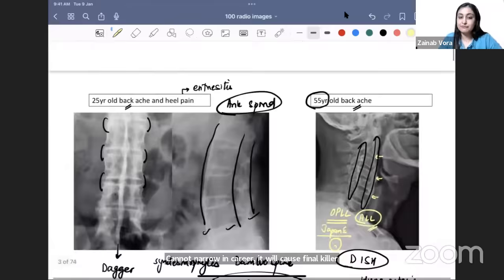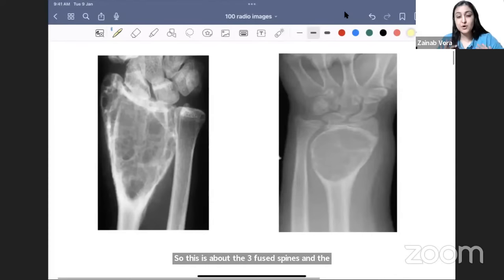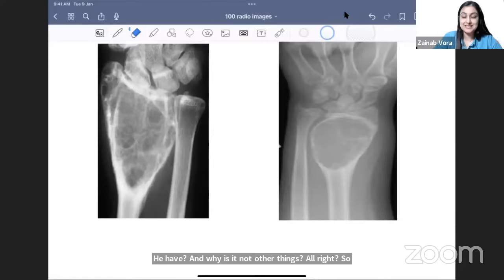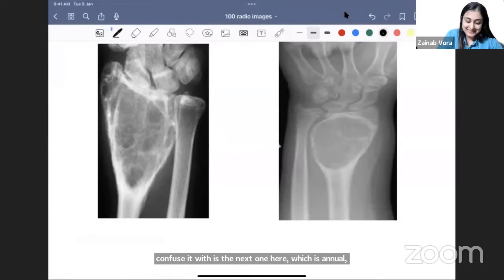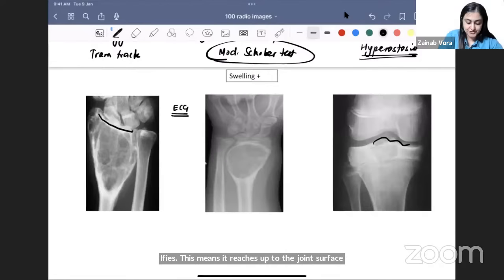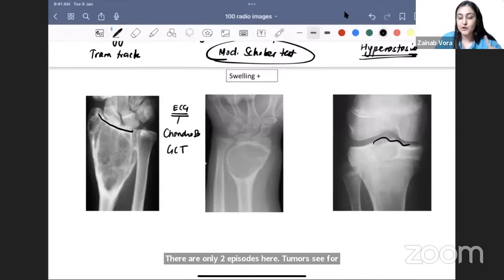Moving to bone tumors — something that confuses people a lot. If an X-ray shows the distal end of radius, first instinct should be GCT (giant cell tumor). The ECG mnemonic: there are only two epiphyseal tumors — C for chondroblastoma and G for giant cell tumor. C for chondroblastoma, C for child — that's how you distinguish by age.